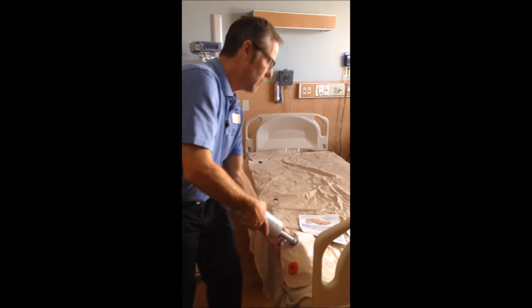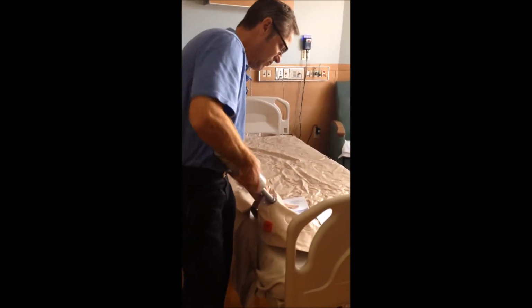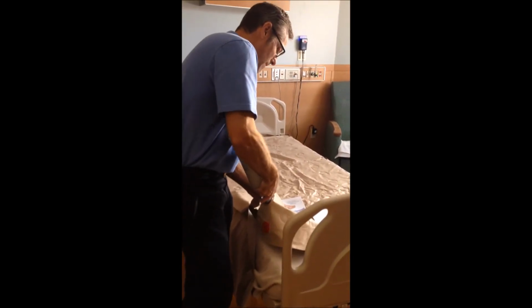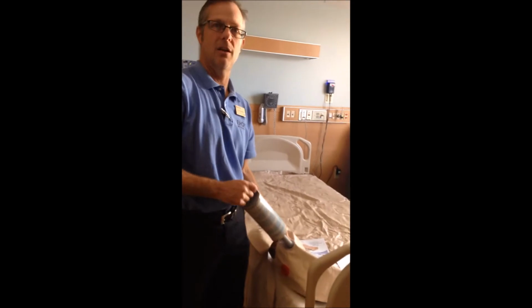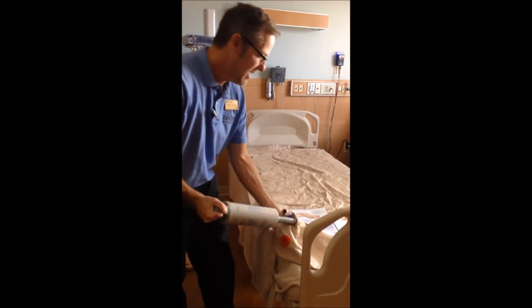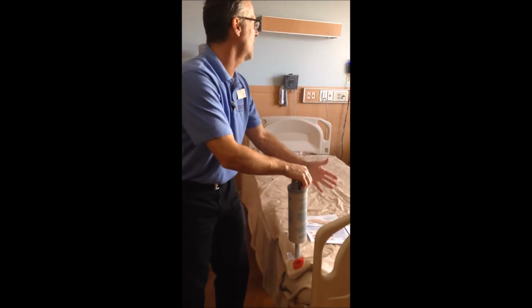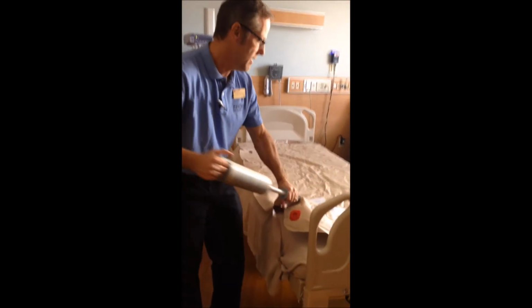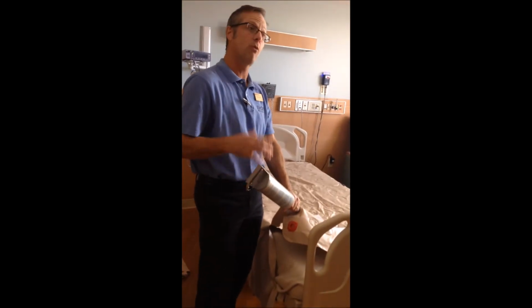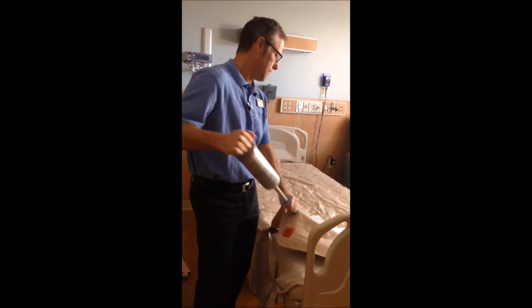With the electric inflator, it takes about 10 seconds. You don't have to be exact, because I'm going to show you a way to check it if you lose track of how many you're doing. What you want to do is take the pump. Don't go straight down into the mattress, because that'll create a suction, either with this or with the electric inflator. Always angle it a little bit. That is one complete stroke. It takes 42. I know it sounds like a lot, but it goes very quickly.